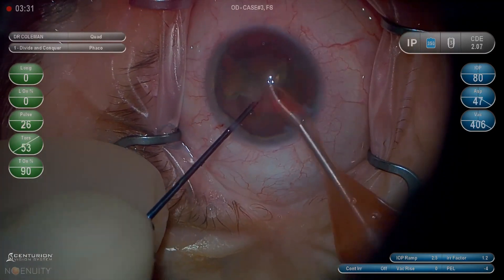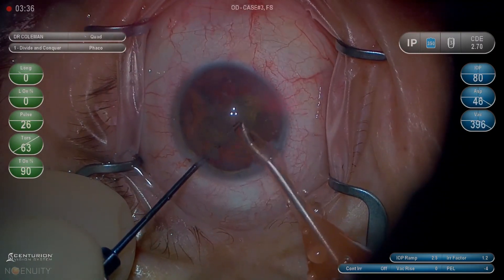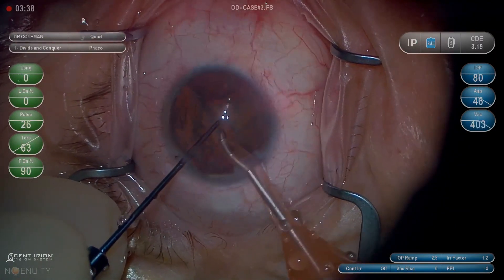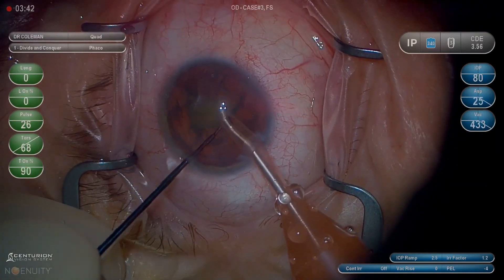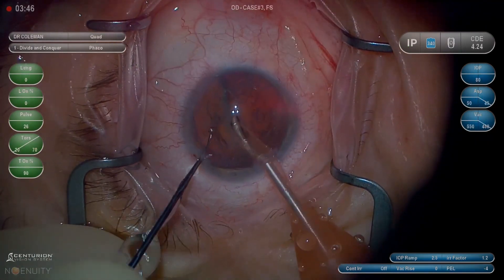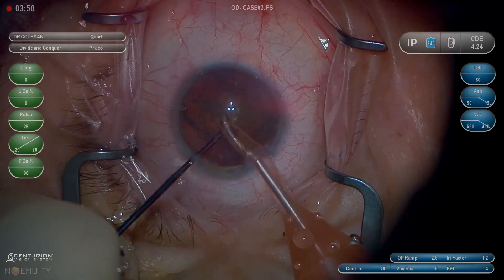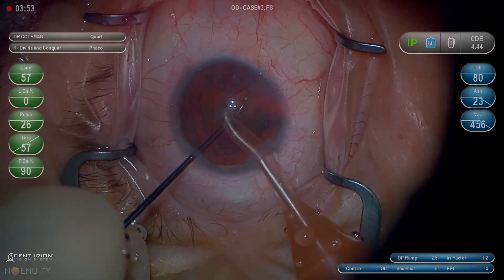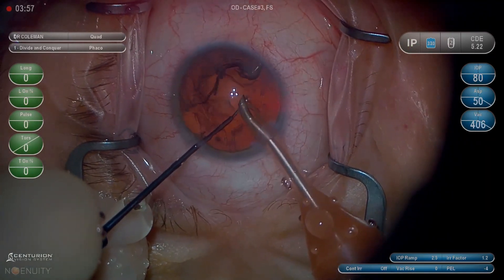That second instrument is the Connor 1. I think it's an underused instrument — it's by far my favorite. I've used several different types. They always seem to have a bend in them somewhere that's not really necessary. I like the Connor because you can reach all the way across the eye. It's really safe. It's got a rounded tip, and it's hard to puncture the capsule using the Connor 1. Of course anything's possible, but generally it's a great instrument — very, very versatile. You can do a whole bunch of things with it.